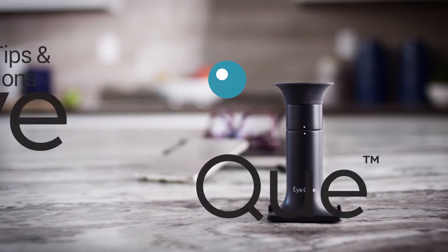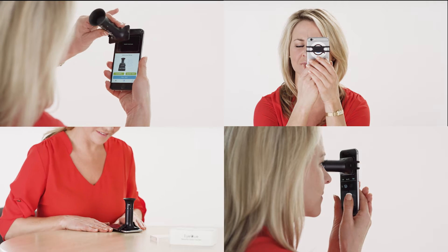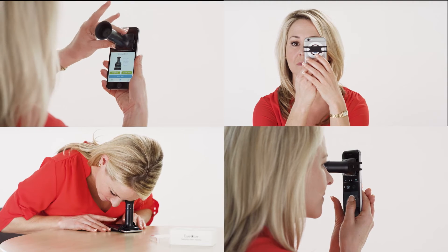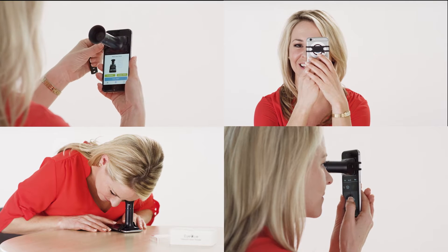Congratulations on your purchase of the IQ Personal Vision Tracker and for downloading the latest version of the My IQ app. Over the next few minutes, we'd like to provide you with a few tips and troubleshooting techniques for using the app and Miniscope to help ensure the accuracy of your test results.